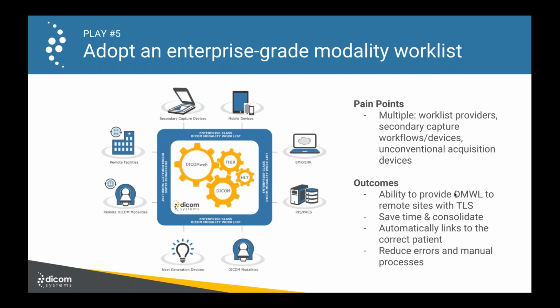So Worklist has a lot of different dimensions, not just the ability of the PACS to take an HL7 order and turn that into a modality worklist entry. And we found that empirically. And again, until you're faced with these workflows in a concrete manner, it's hard to figure out what you're going to need to do with these workflows. And there's no such thing as a cookie cutter approach.